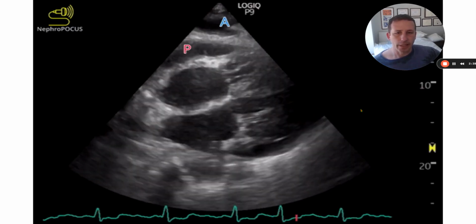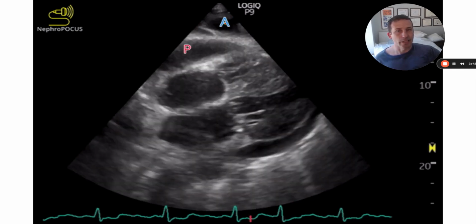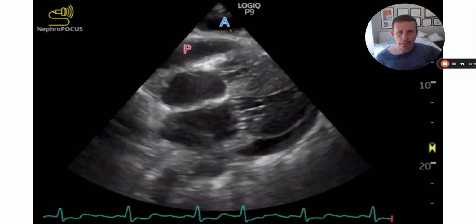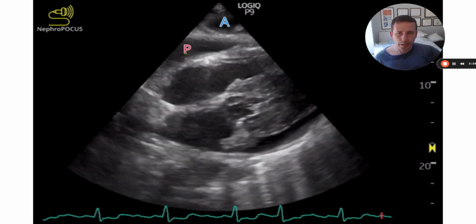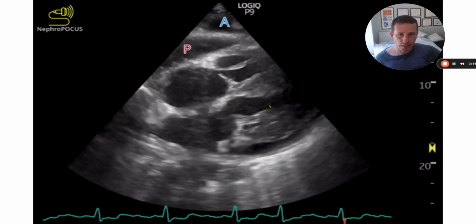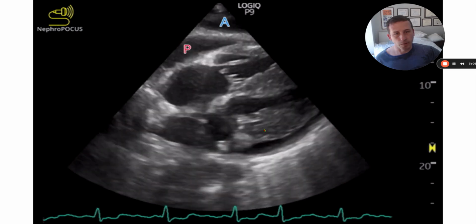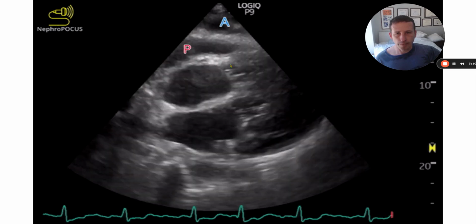This is an image depicting a pericardial effusion. This patient also has ascites, so you're not seeing liver in the near field there. Probably it's a cirrhotic patient whose liver is contracted a little bit from cirrhosis. And so we've got ascites here labeled with the A. Our P denotes that pericardial effusion, and then we've got all of our chambers here, RV, LV, LA, RA. That LV looks very thick, so it's probably some kind of hypertrophic cardiomyopathy, and then you can see a pericardial effusion tracking around it.